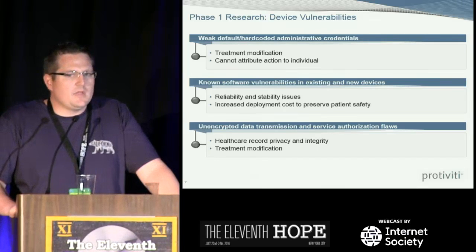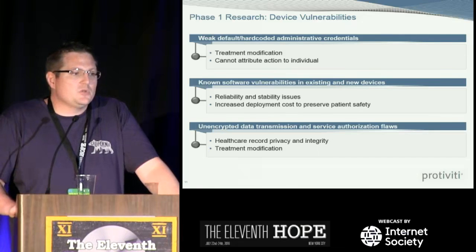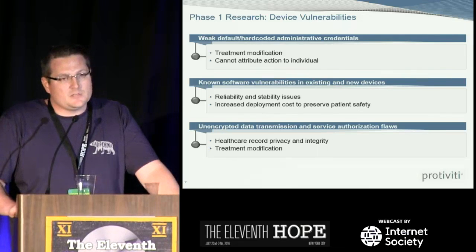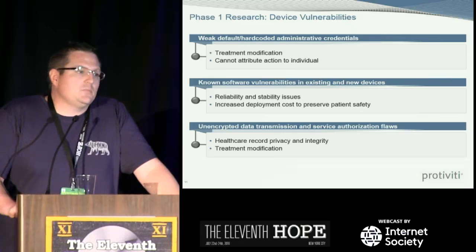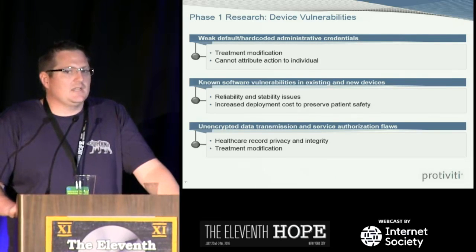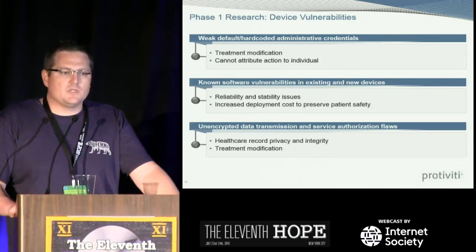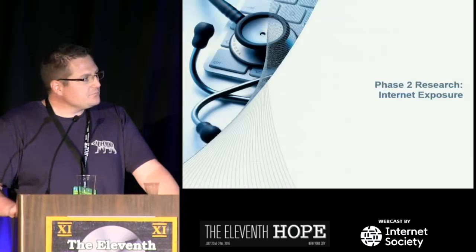So you can man-in-the-middle that, alter that data, and ultimately cause data integrity issues and push incorrect data into the medical record system. Research has been done on bad data leading to misdiagnosis, mistreatment, those types of things. So it's definitely a safety issue, not just a privacy issue.